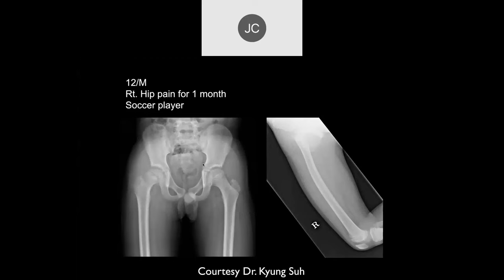12-year-old with right hip pain for a month. On the lateral view of the femur, there may be bowing of the femoral diaphysis, but actually the arrow was supposed to indicate the problem. There's widening of the growth plate under the right femoral epiphysis.